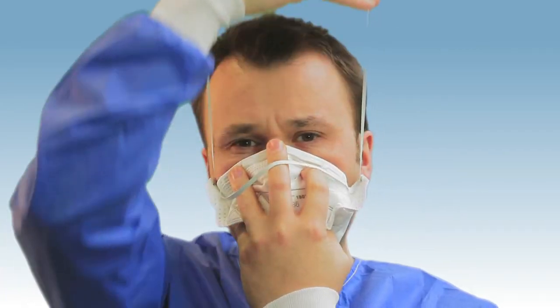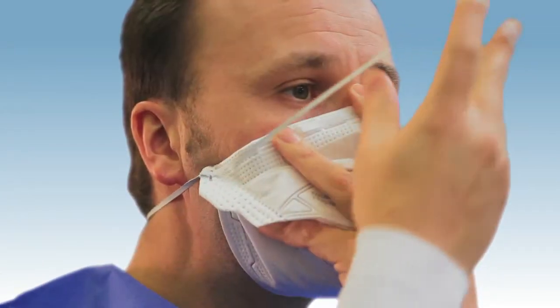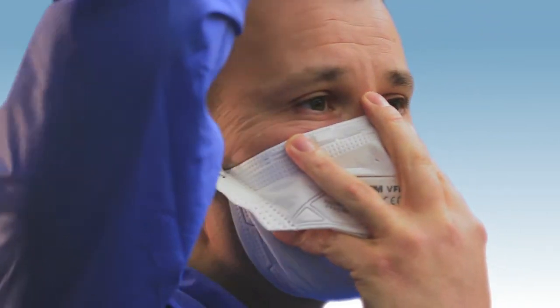Take the first strap, stretch it over the back of your neck below your ears, then stretch the second strap across the crown of your head.